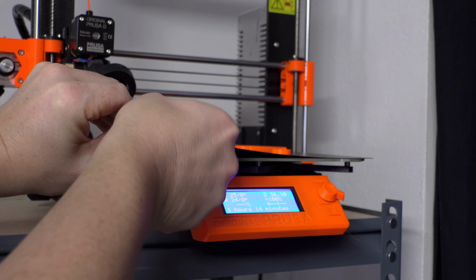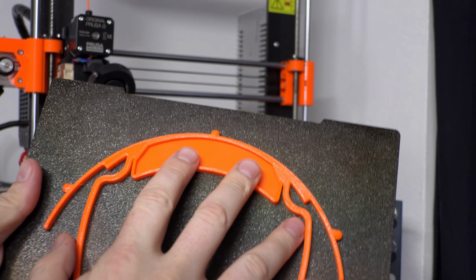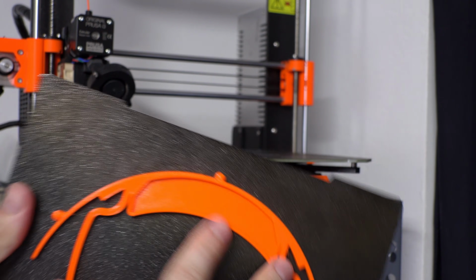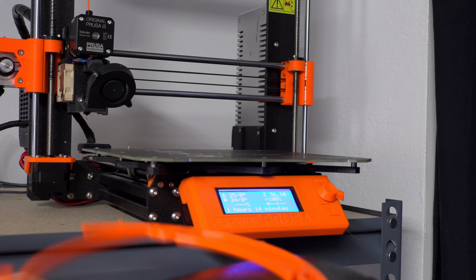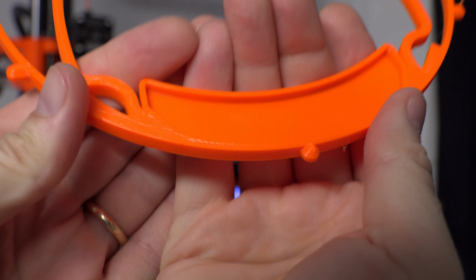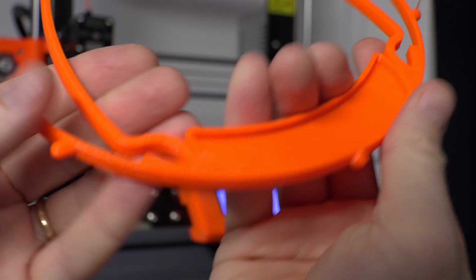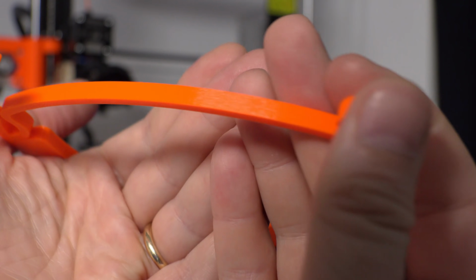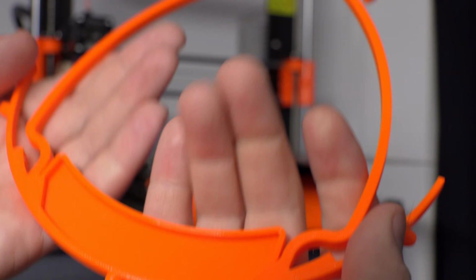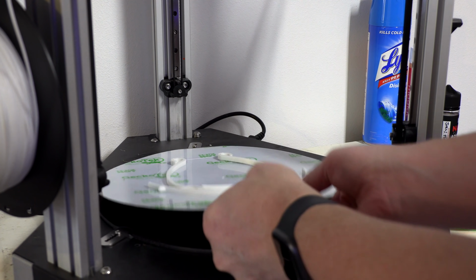Let's keep going. This Prusa's done right here. Let's get this up. There we go. This is in Prusament PETG, the PPE edition. Let's get it off. Love those build plates. Let's get a closer look. That looks fantastic. I really, really like how that looks. Good job printing that. That's good, that's good. One more machine to get. Now we're on the Artemis. This is with Creality filament. Oh.